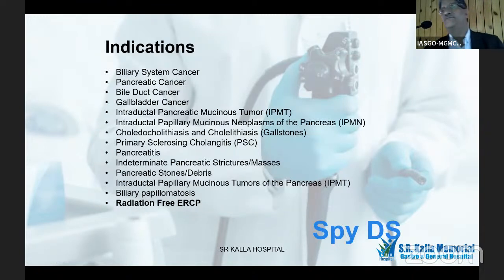So what are the indications for this particular technology? Biliary system cancers, biopsies can be done. When we do a biopsy, this is a surgical conference, but there's an important point I want to raise. With the advent of IHC, IgG4 related cholangiopathies are coming up in a big way. In our center in the last 4 years, we have avoided some 12 Whipple surgeries because the diagnosis for them was IgG4 related disease. And these were the patients who underwent stenting along with steroids and then they had cure.